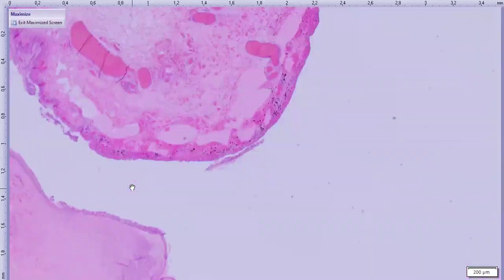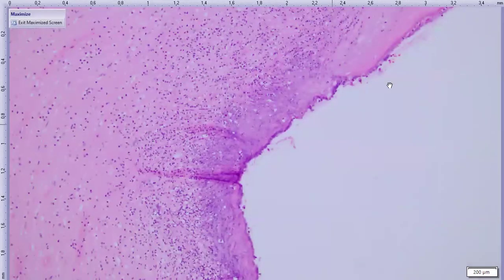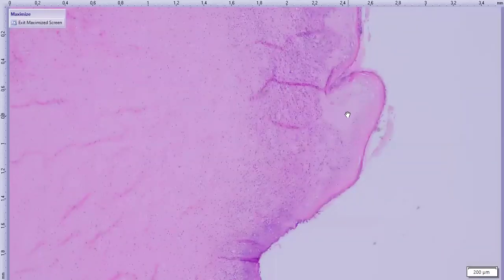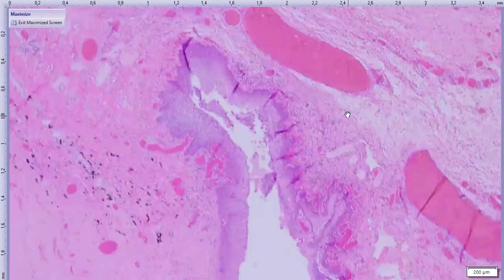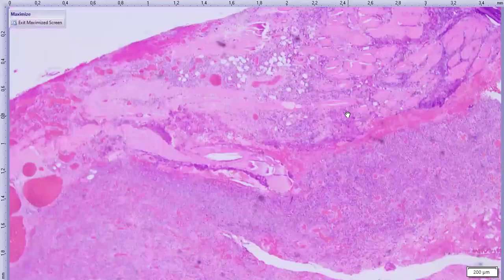We'll briefly come back to the cornea just to prove to you that it's ulcerated and severely inflamed. No epithelium, tons of neutrophils, probably some edema in the ulcer bed. But the main event is over here. Back to where we were.